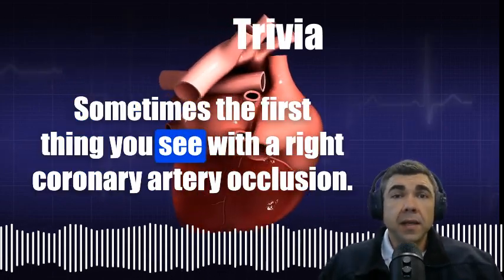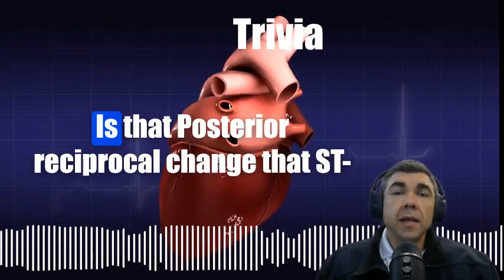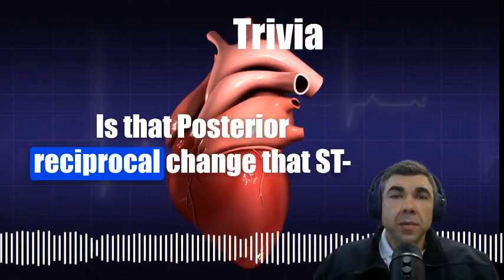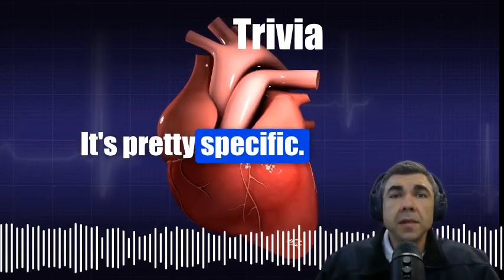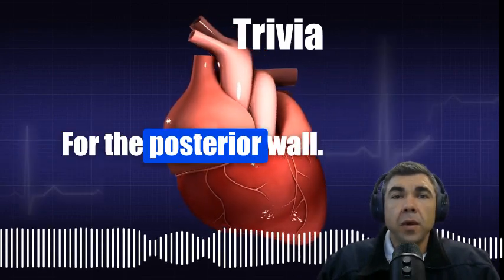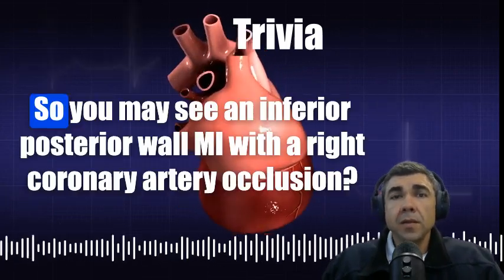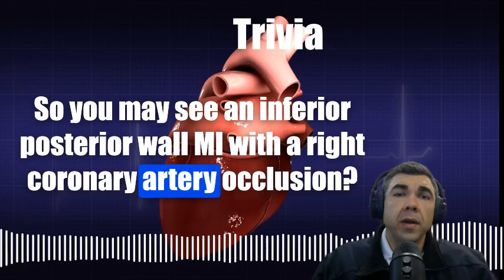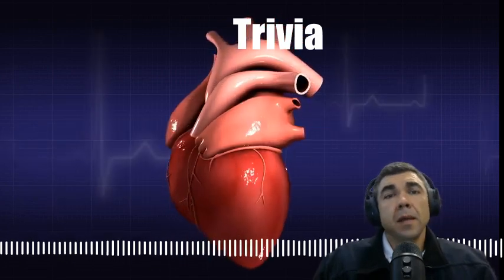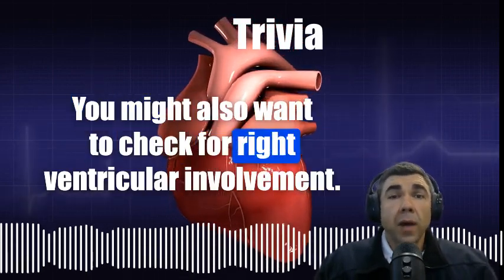Sometimes the first thing you see with a right coronary artery occlusion is that posterior reciprocal change, that ST segment depression in leads V1 and V2. It's pretty specific for the posterior wall. So you may see an inferior posterior wall MI with a right coronary artery occlusion. It's very common. You might also want to check for right ventricular involvement.